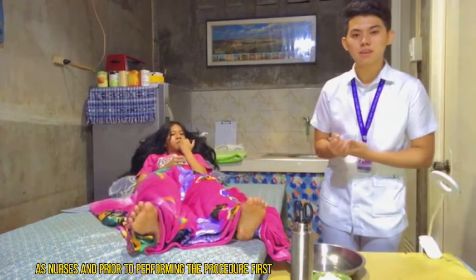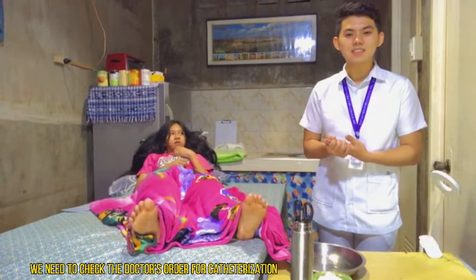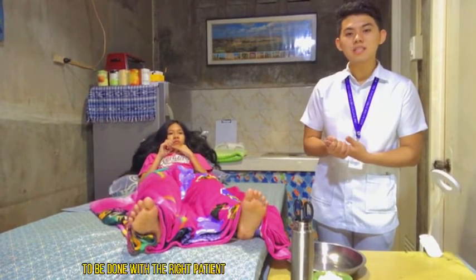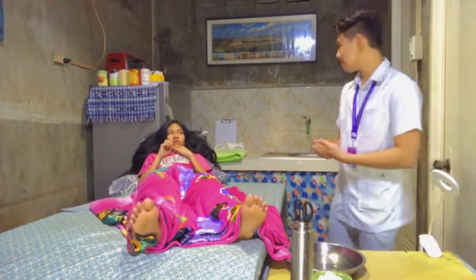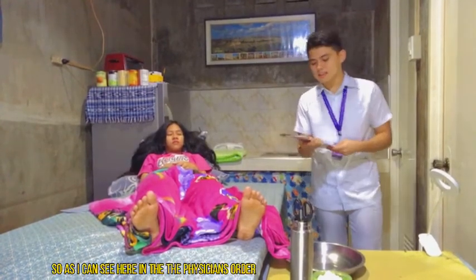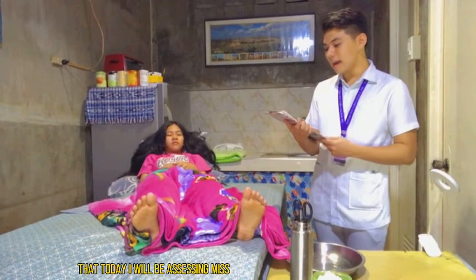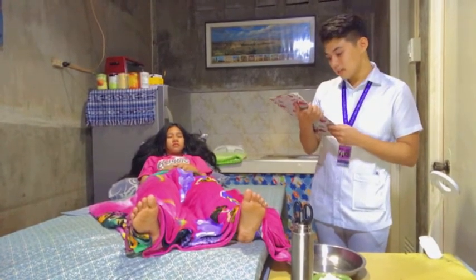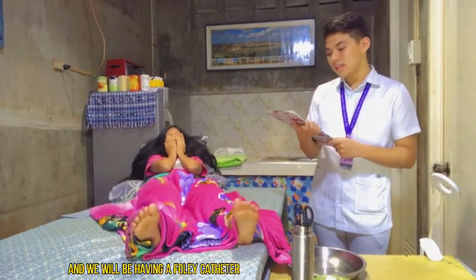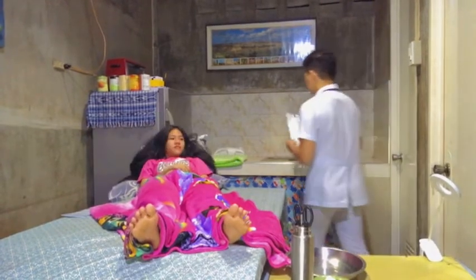And prior to performing the procedure, first we need to check the doctor's order for catheterization for us to ensure that we will be performing the right procedure to be done with the right patients. So as I can see here in the physician's order, it was aforementioned that today I will be assessing Mrs. Justine Velasquez, and we will be having a Foley catheter and of course a specimen collection, and that will be it.